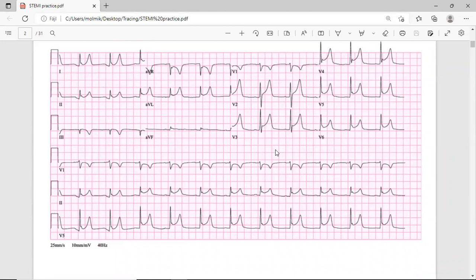Okay, you can have Q wave and only ST elevation and included the T wave. It's still acute. If you do see a Q immediately and ST elevation, that's acute immediately. Okay, independent, because the T inversion occurs at the late phase of an acute, only in the late phase, before the subacute starts.